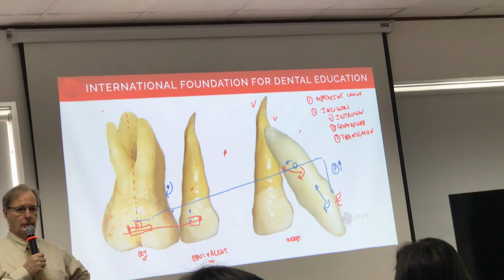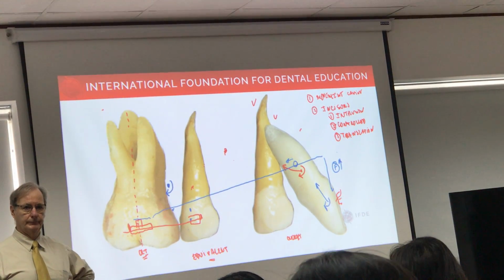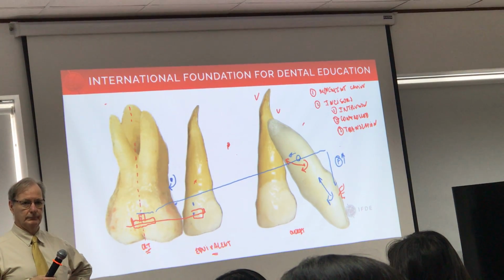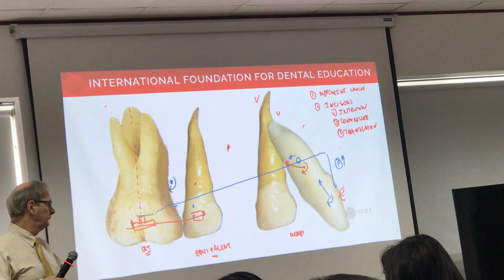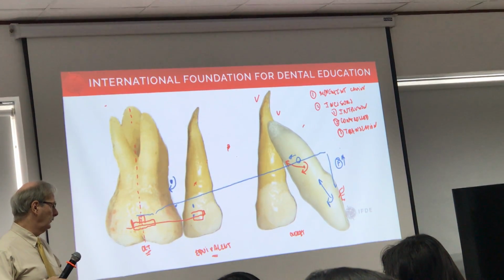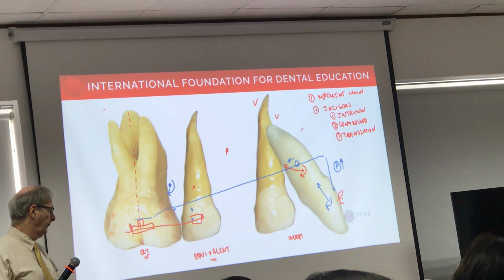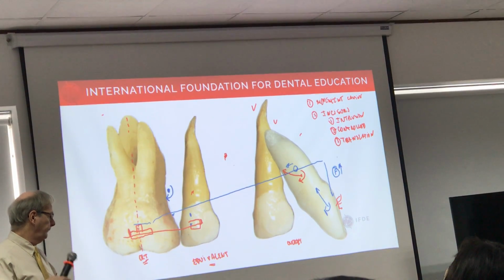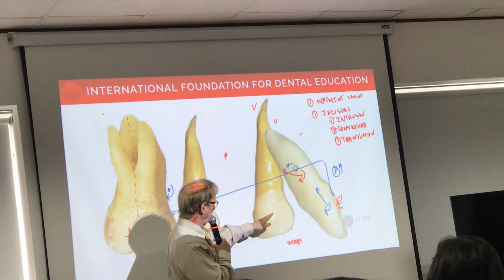We have a question in the back. Yeah, if we're doing that system there, because I see this routinely, where you want to start getting that canine tipping back, can you take that segmental wire that you've got at the moment through the molar, second bite, up to the canine, and just do a small tip back bend on that? That would then again be... You mean increasing? Something like this? You got it, yes.